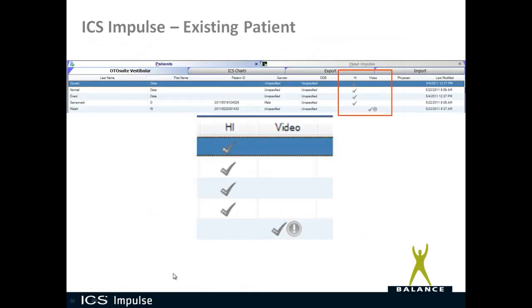When you look under the existing patient, you will see that if a video is recorded, there will be a checkbox, which you see down here. And then if that unique identifier was selected, you'll see the exclamation point in the existing patient list.